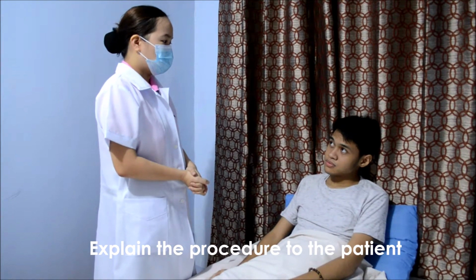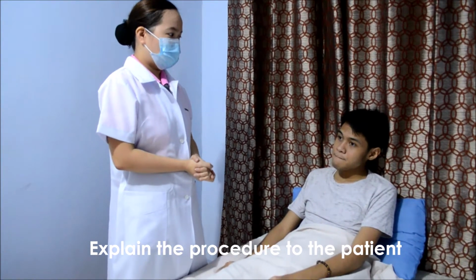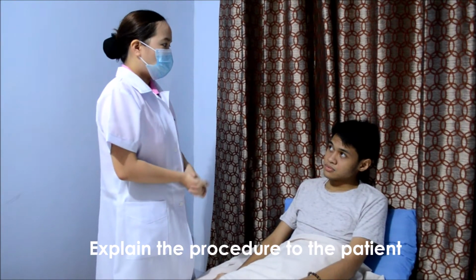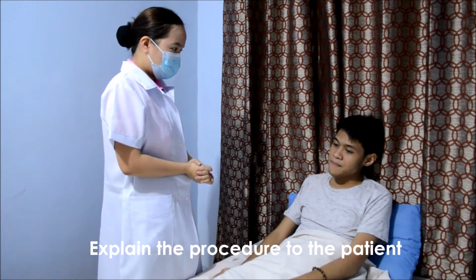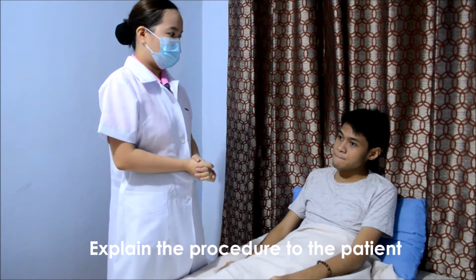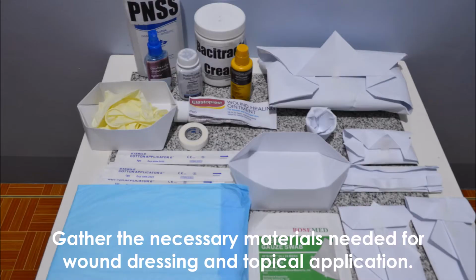I will be performing the wound dressing, so it is to protect the wound from microbial contamination. And explain topical application. It is to deliver medication directly onto the areas of the skin that are irritated, inflamed, itching, or infected. Then gather the necessary materials needed for wound dressing and topical application.